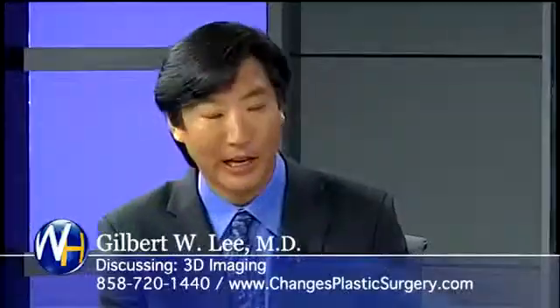So on a nasal surgery, rhinoplasty, or a facelift, you can show them predictably, this is what you're going to look like. Yes, absolutely. And more importantly, I get the patient's input. I like to show them an example and say, now, what do you think of that? And if they say, I want the dorsum down a little more, the hump off, I want the tip up, show me with a skinnier tip, it allows them control over their result.